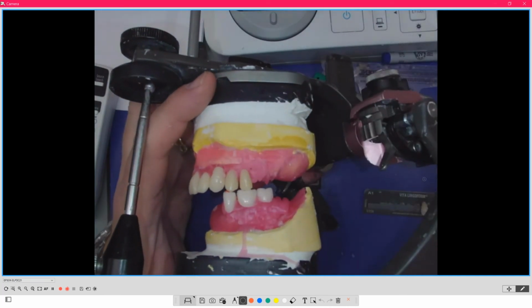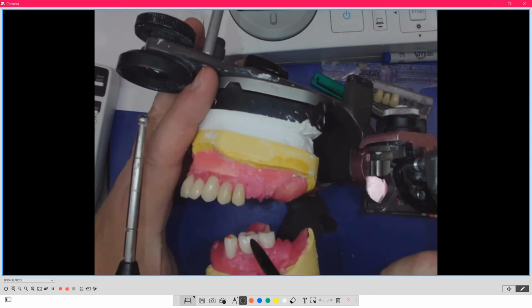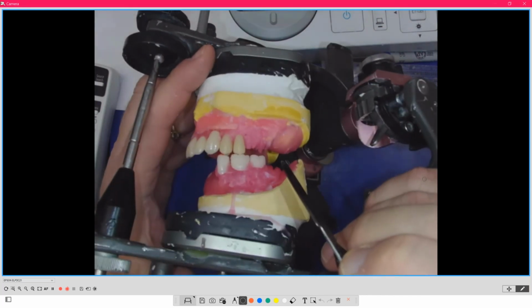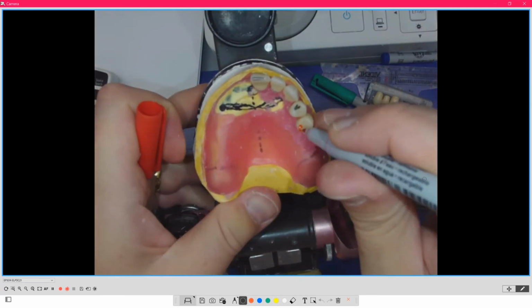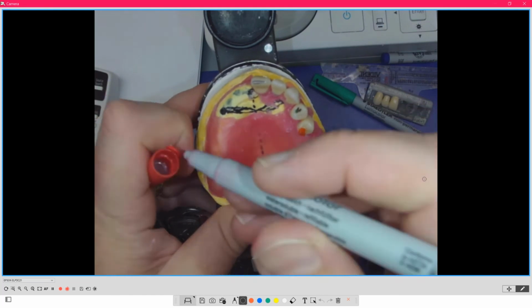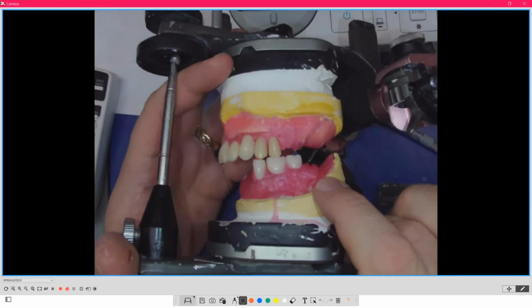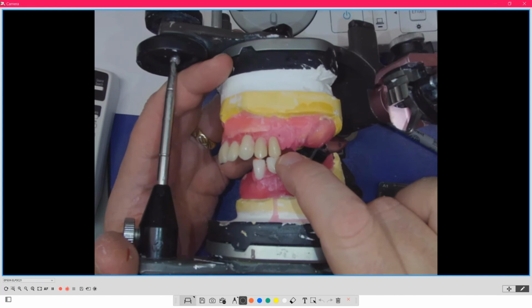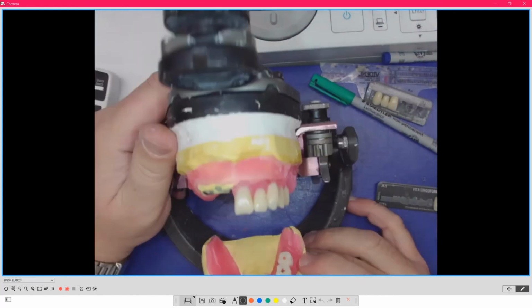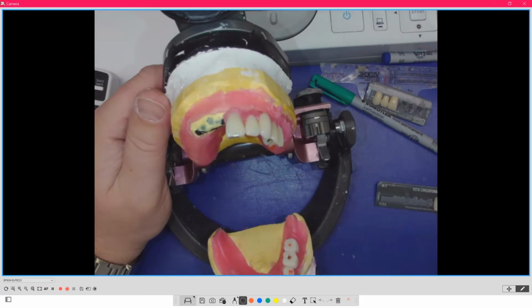Why can't I do that? Because look what it just let me do. That lingual cusp went into the fossa of the lower. So that's this cusp. So that red cusp went into the fossa of the lower. So now I can put in even another second molar. So here's the thing. Sometimes it's not the ideal, but what I'm doing is I'm putting a hammer into a bowl. I'm putting a cusp into the lower corresponding fossa.